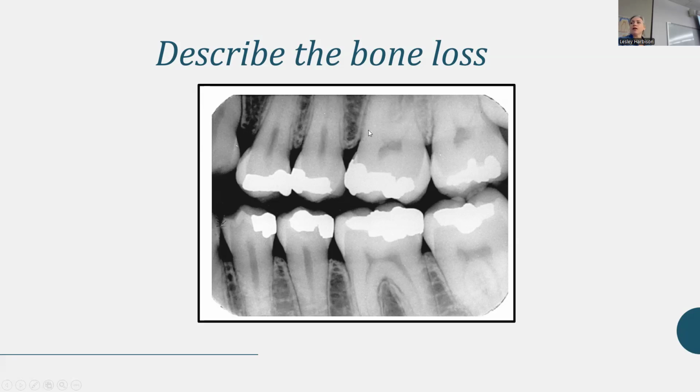But I have other things that I can say this patient looks relatively healthy, so I'm just going to lean on that. I'm going to err on the side of they're healthy because I don't have probings. I don't have a clinical exam. I know that can feel unsatisfying, but otherwise some people are going to say healthy and some people are not. I want us to land on the same page.